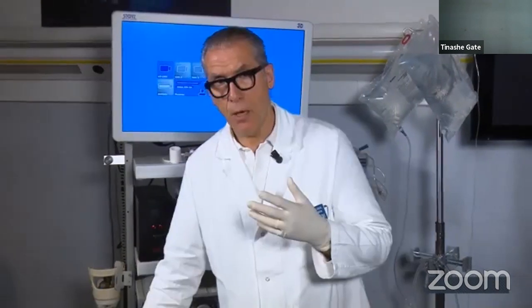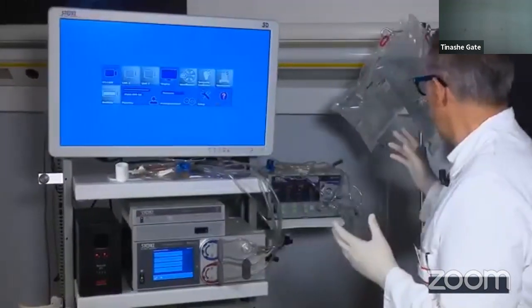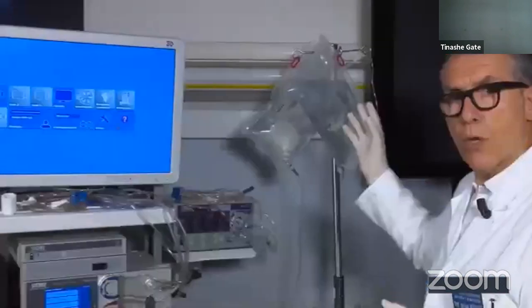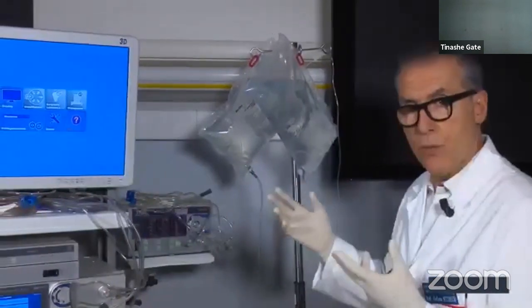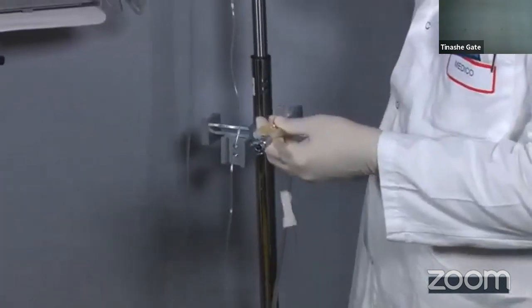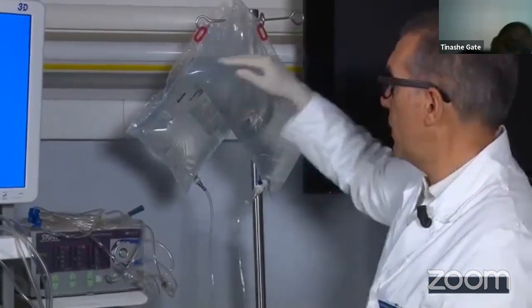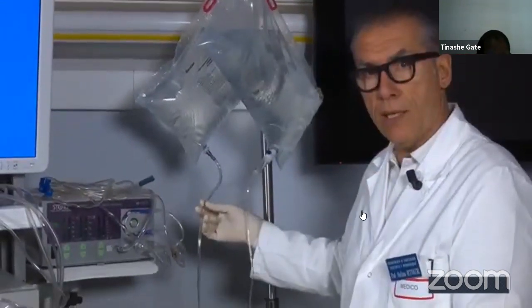If you understand this basic concept, then we go into the devices to keep a constant pressure inside the uterine cavity. The most known ones are the gravity bags, using gravity pressure. Probably these are the most used methods to inflow the liquid. But as you can understand, it depends on the position. So I prepared an example based on 2 sacks of 5 liters, in the same position, so they have the same level compared to the floor, but connected with 2 different silicone tubes.